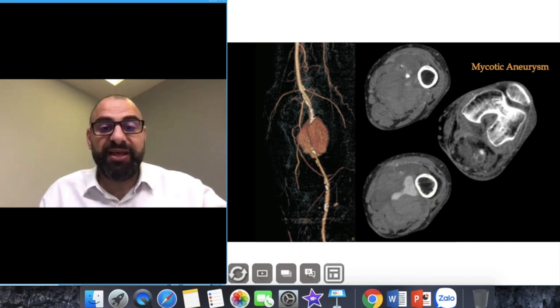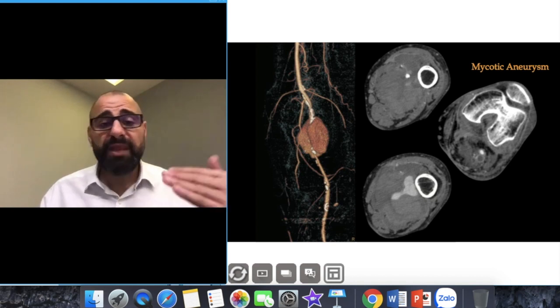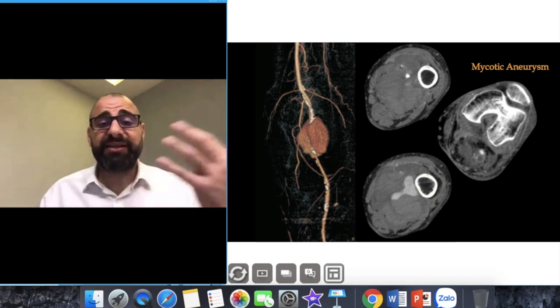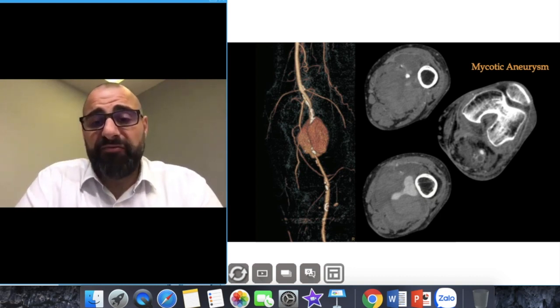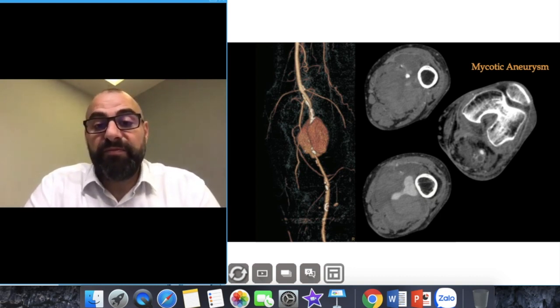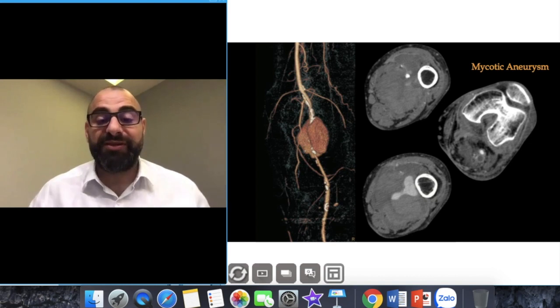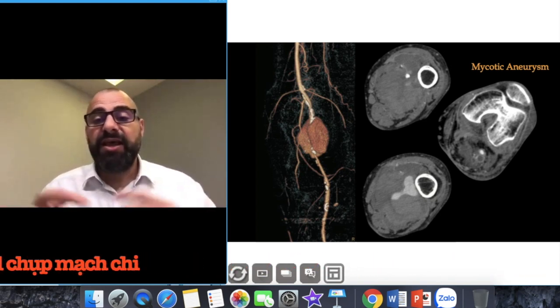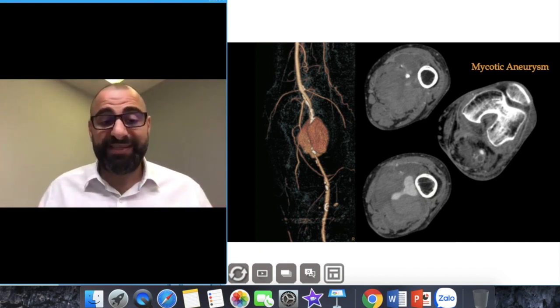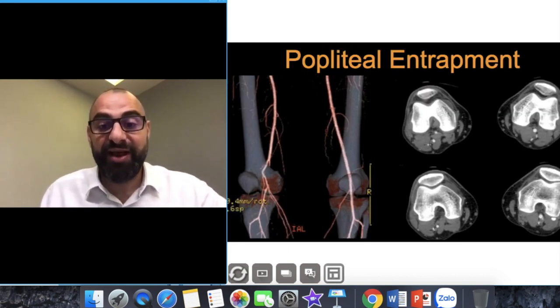This is a mycotic aneurysm at the popliteal fossa — again demonstrating why disease likes to happen there. I scanned below and it filled up nicely. You can see the pseudo-filling and the inverted T shape wrapping around the vessel. We're not bothered if we got the aneurysm filling perfect — as long as the vessel is filled well. This is a perfect example showing that using this technique fills aneurysms, stenoses, infective aneurysms, and gunshot/stabbing injuries every single time.